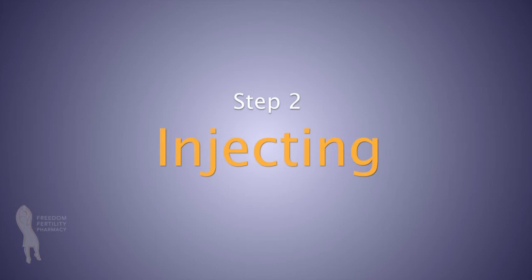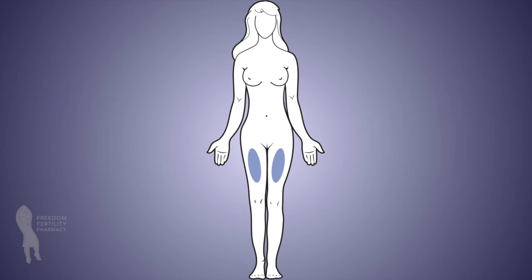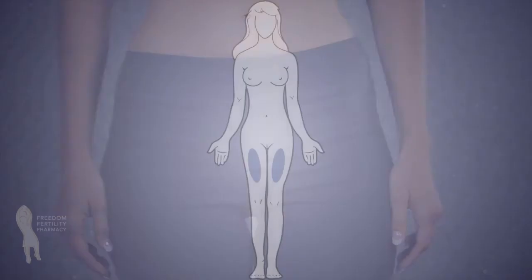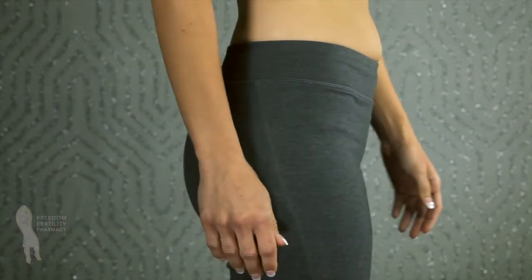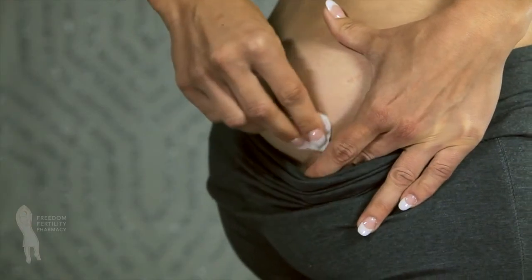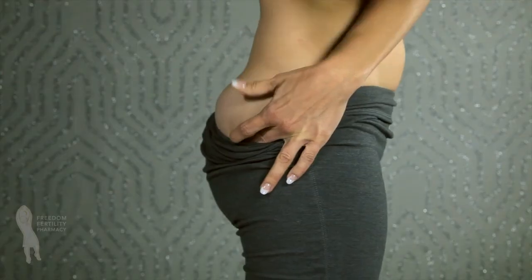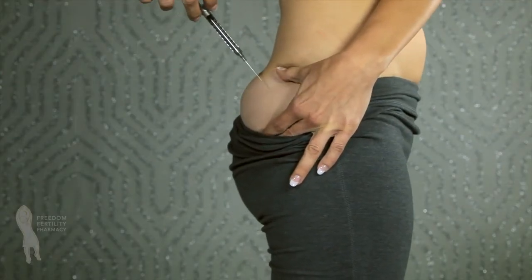Choose an injection site as directed by your healthcare provider. Common sites for intramuscular injections include the hip, upper outer quadrant of the buttocks, and the outer area of the mid-thigh. For this injection, the upper outer quadrant of the buttocks will be demonstrated. Clean the injection site with an alcohol swab and allow to air dry. You should alternate injection sites each day.